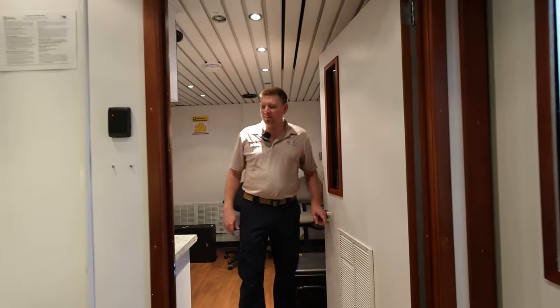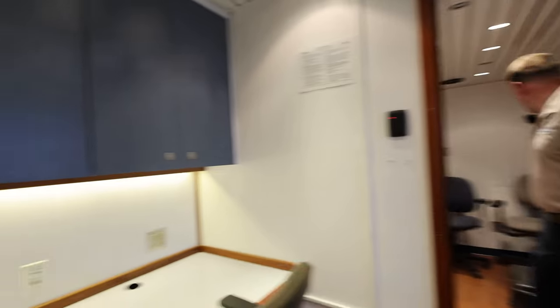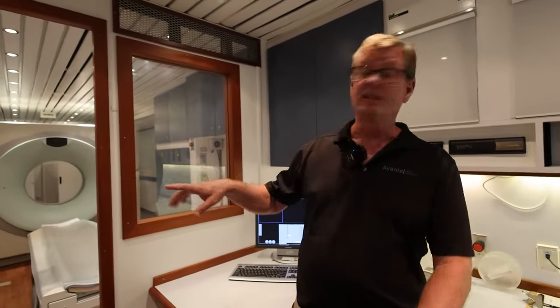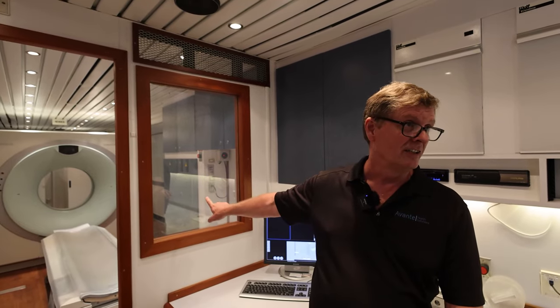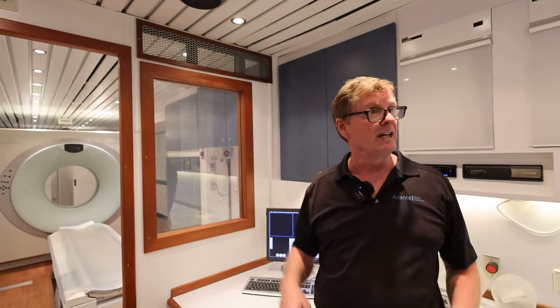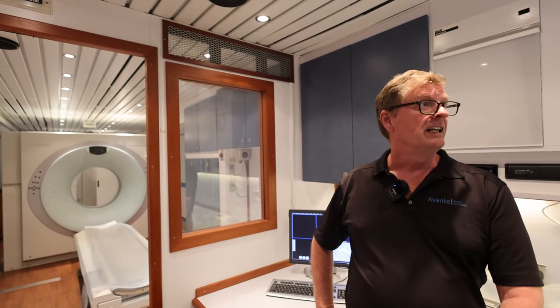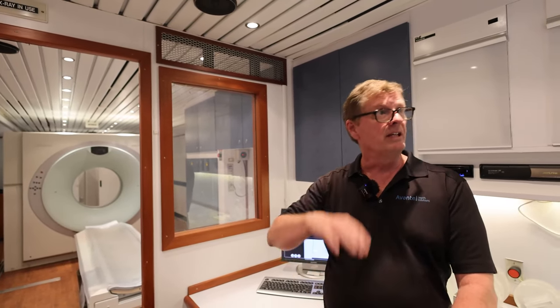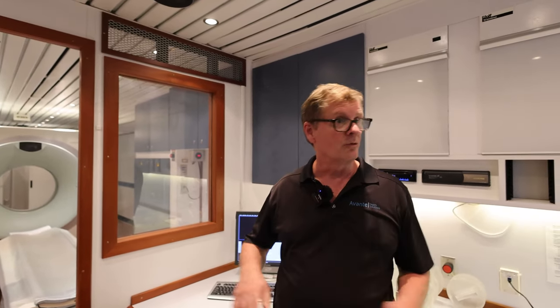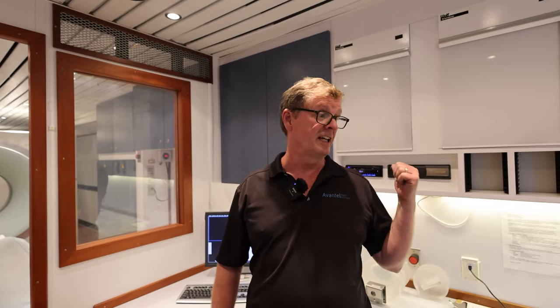You'll notice on these CT trailers and the Cath Lab trailers, unlike the MRI trailer, these have pop-outs on the sides. So when you park them, the sides spread out, making room to get around. In an MRI environment, you don't want to be going around behind the magnet. But in a CT or a cath lab, you want to be able to get all the way around. Most prevalently in the cath lab, because it just shows more operating room.